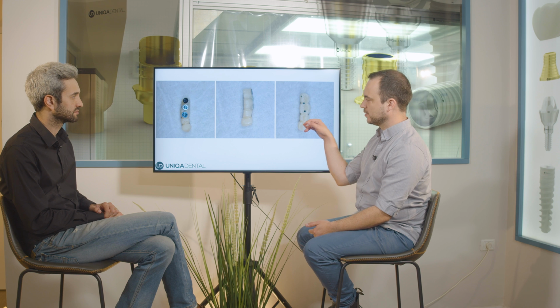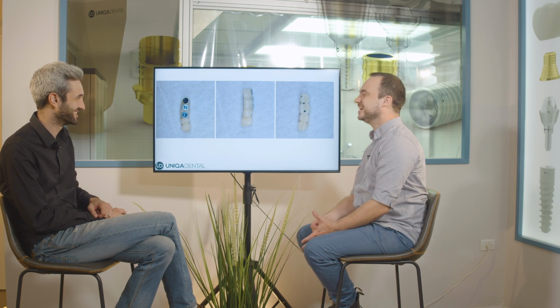Yeah, it will hold. It's a little bit risky because of different forces that can be applied on this cantilever, and maybe it can break. But it really depends on the case. It depends on the patient, different parafunctions. If he's a vegetarian or a carnivore. Yeah, very much. It depends on the patient, it depends on the situation. You need to choose what to do.